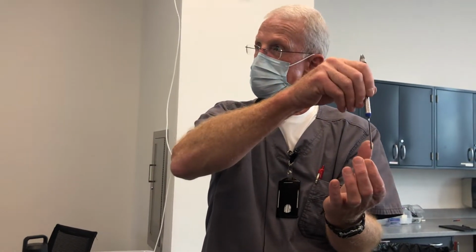Spread it to the margins, and then you've got a clean, dry tooth, not over dry. Not over dry, don't desiccate with these. You just take the sheen off so there's no puddles anywhere on your tooth, and then put it into place. Make sure it seats fully. Check that you've got good cotton roll isolation. Check by having the patient bite and give you some feedback. You've tried it in, you've adjusted it if necessary.